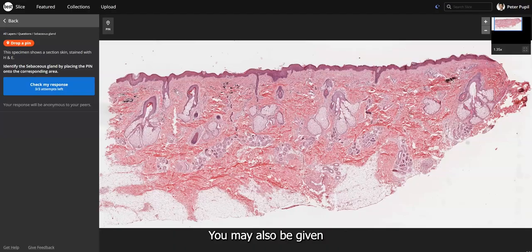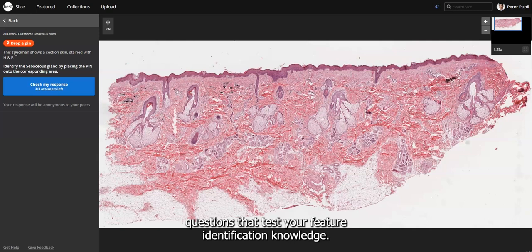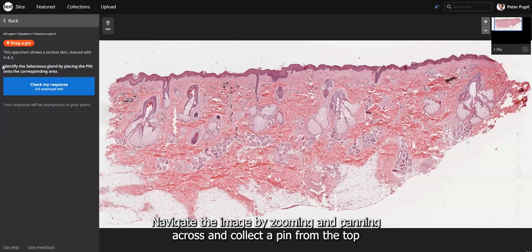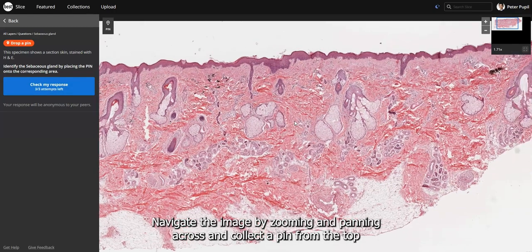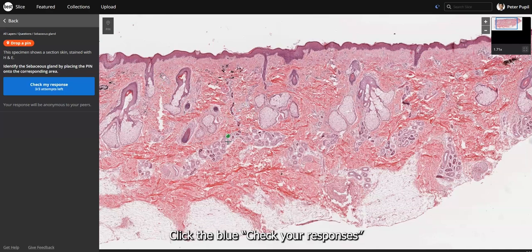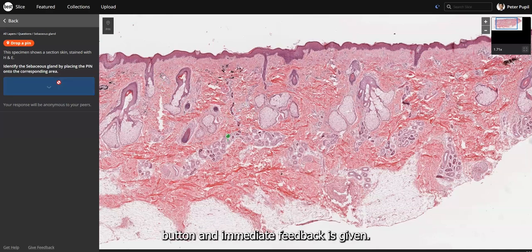You may also be given questions that test your feature identification knowledge. Review the question on the left, navigate the image by zooming and panning, and collect a pin from the top left-hand corner to indicate where you believe the feature is located. Click the blue Check Your Responses button and immediate feedback is given.